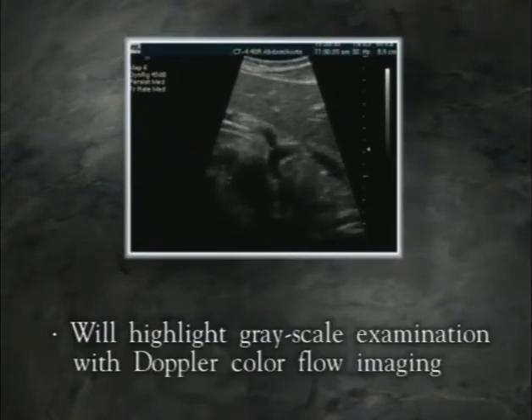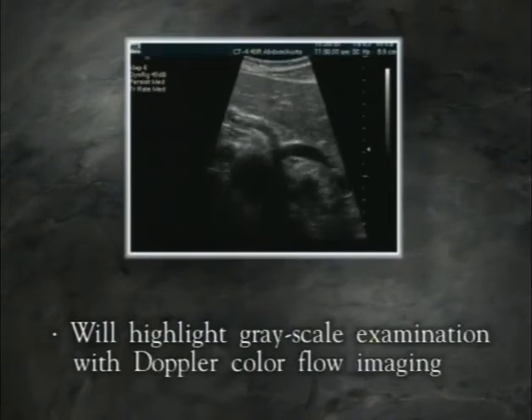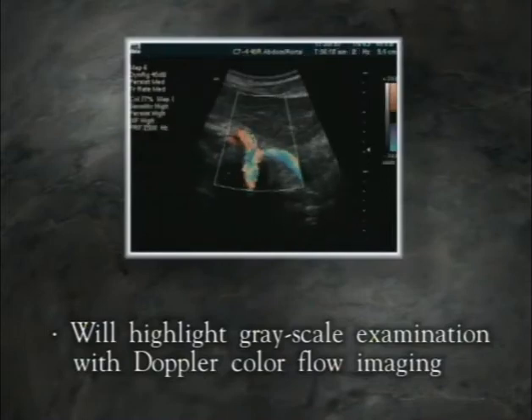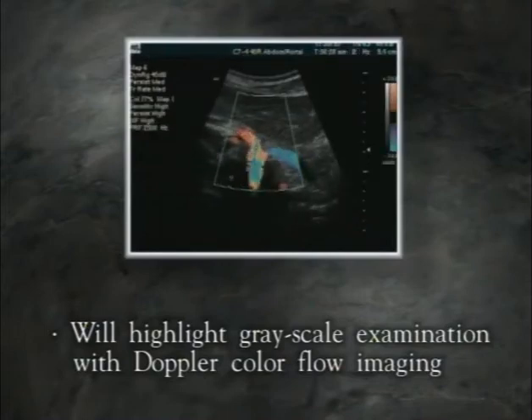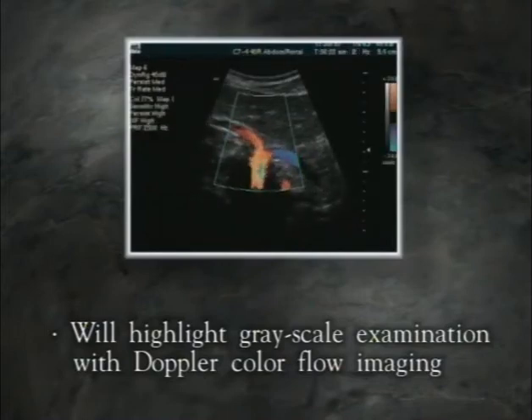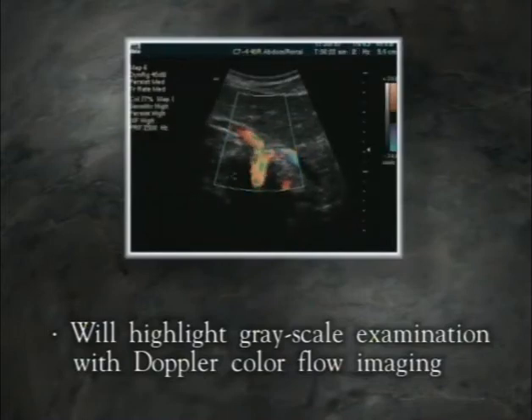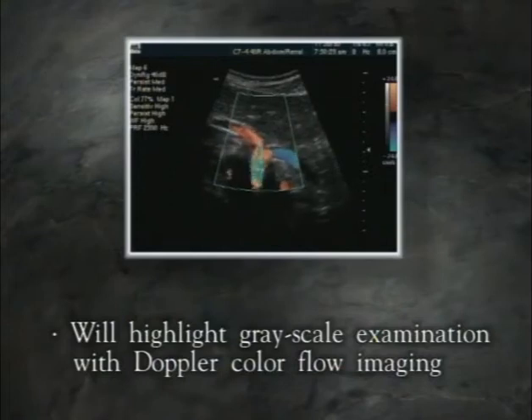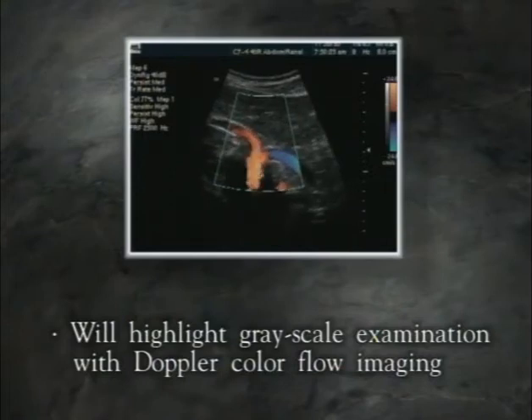The grayscale examination will be highlighted with color flow imaging, which facilitates locating the arteries and veins and identification of areas of focal flow disturbance within the vessels.